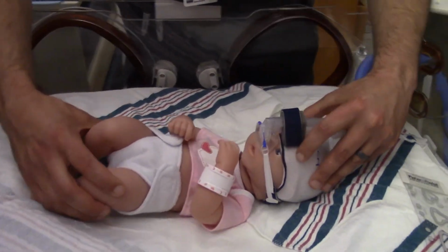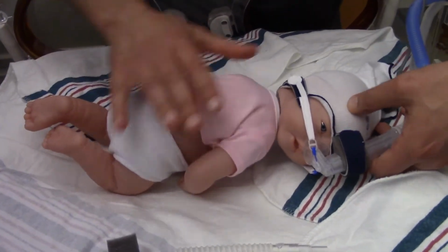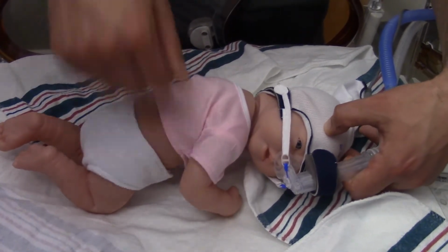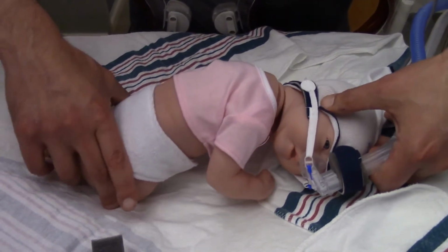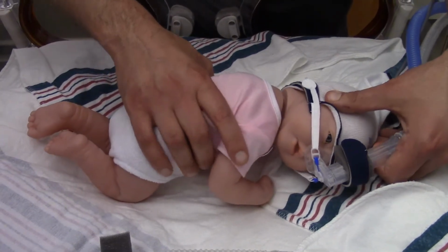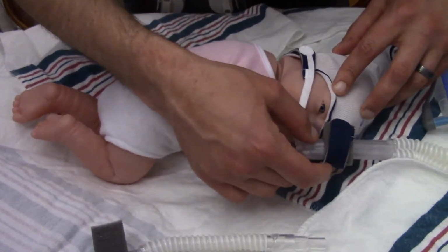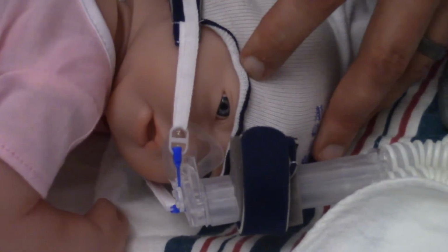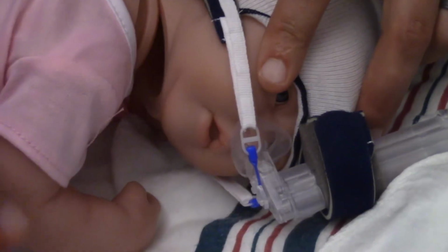All right, so positioning, we can go prone, okay? So if the baby were laying down, we can still position our CPAP. Having a little surfboard underneath definitely helps. Like I said, again, I can't stress how non-compliant this baby is. But again, we still want to target keeping our trunk level and straight, mask in good position. You can tuck the hand up underneath the chin if need be, or a binky right there.